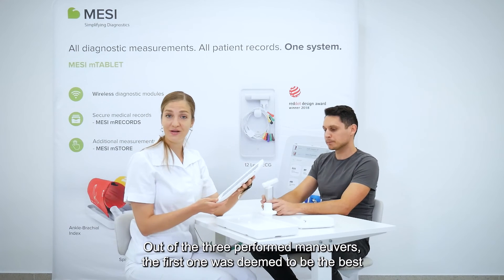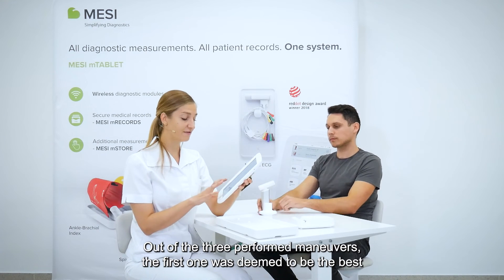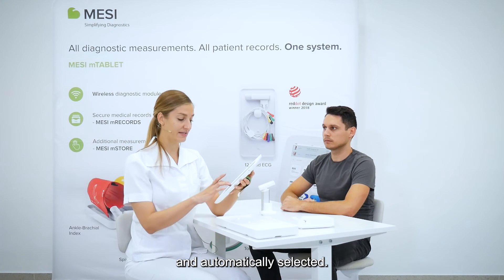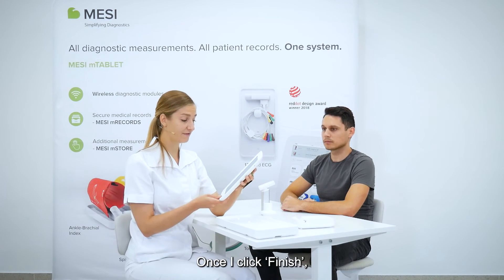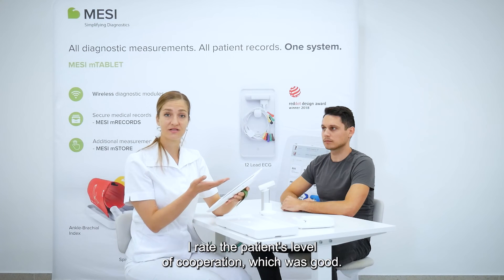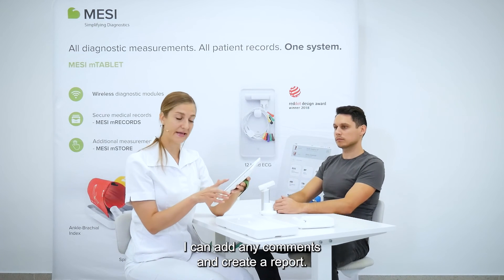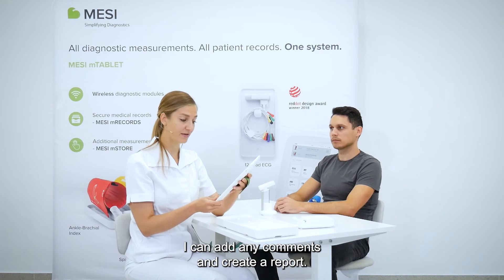Out of the three performed maneuvers, the first one was deemed to be the best one, which is why it was automatically selected. Once I click finish, I can rate the patient's level of cooperation — which was good in this case — add any comments, and create a report.